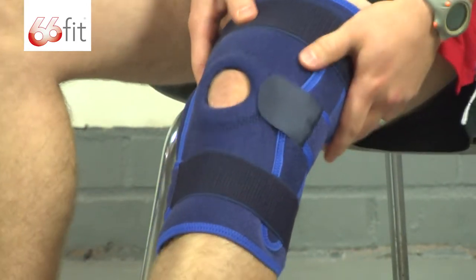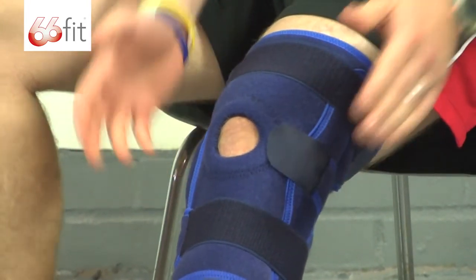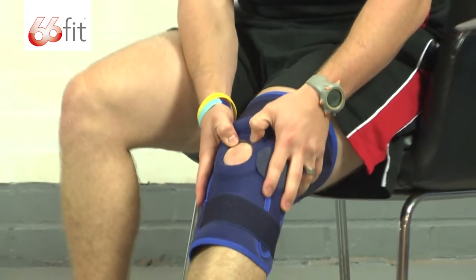Now at this point, if you do need to make any further adjustments — if you need to loosen stuff off, tighten it up a little bit further, or just reposition it left and right — that's when you'd want to do that.